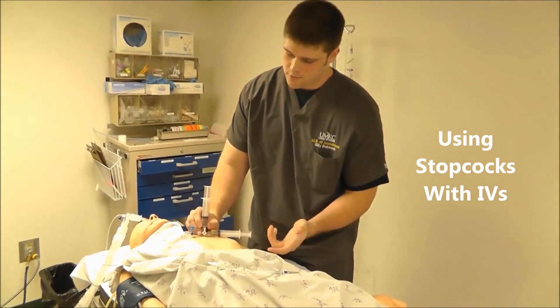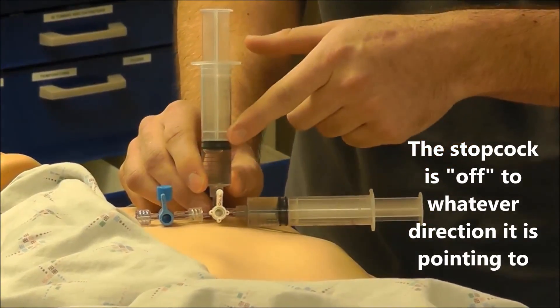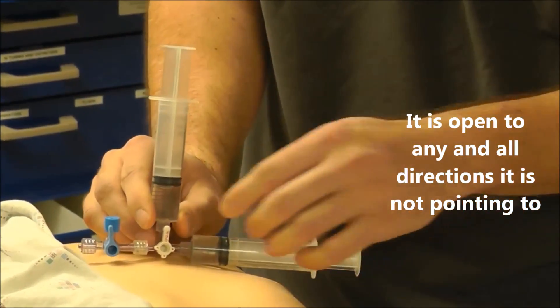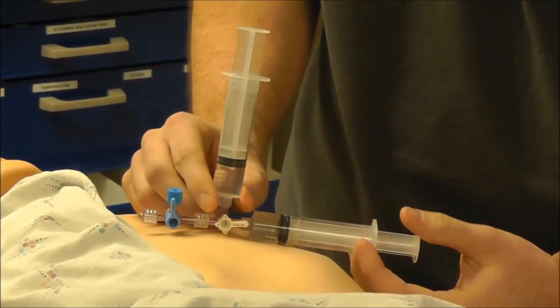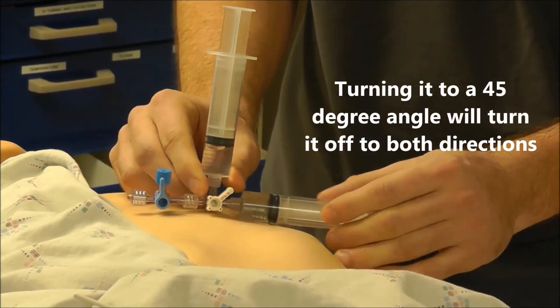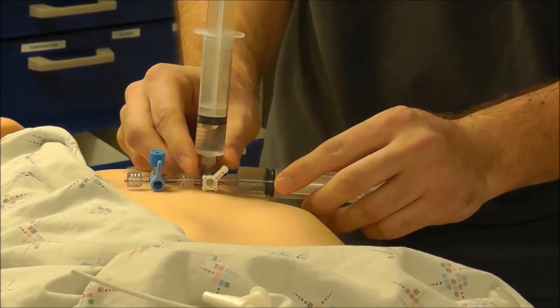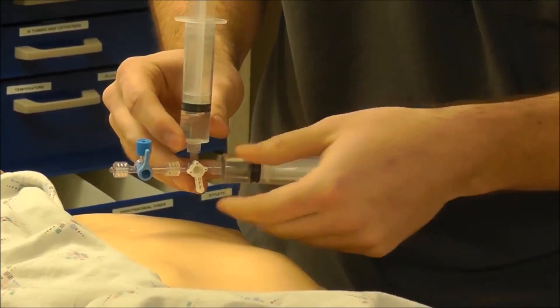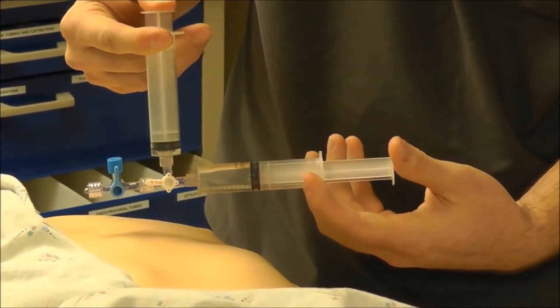Now I'll show you how to use a stopcock. The key thing to know is that whichever way the stopcock handle is pointing is the port that's turned off. So if it's pointing at the syringe, that syringe is off and you can push from the other one. To turn both off, put the valve halfway between both ports, or close the adjacent port. To open it to both syringes, turn the stopcock to the down position and you can push both drugs. Also note that with the stopcock in a certain position, you can push one drug into the other line or vice versa.